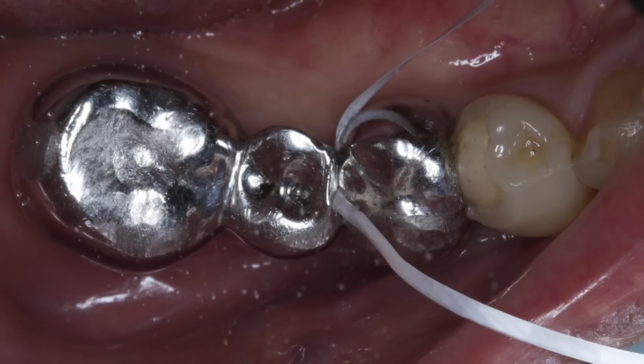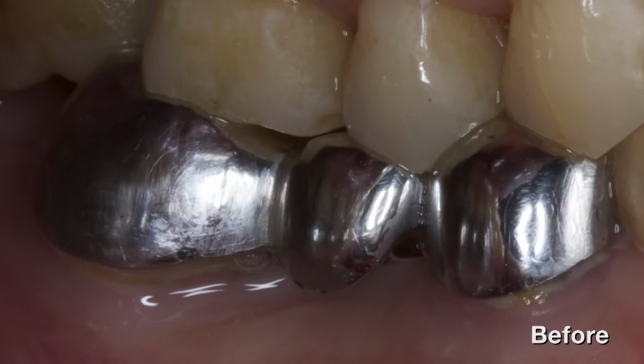But here you can see that I was able to pass the floss all the way through the interproximal area between the Pontic and the abutment, and I did this without tearing the floss. The surface felt smooth. When I asked the patient if he remembers biting on something hard or if the bridge felt movable, the patient reported that he was aware the prosthesis was actually made of 2 separate pieces. He also reported that his previous dentist cemented one piece first, then the other.